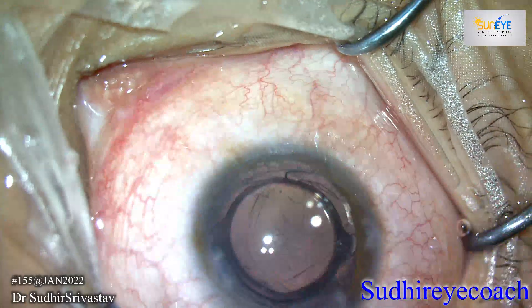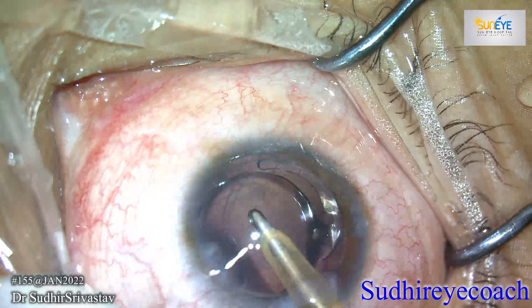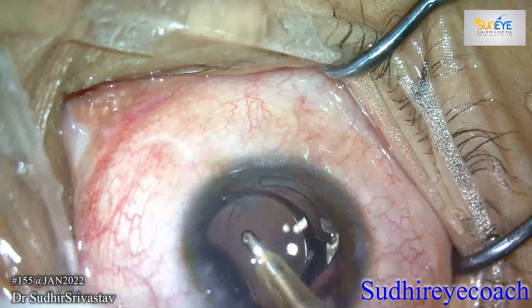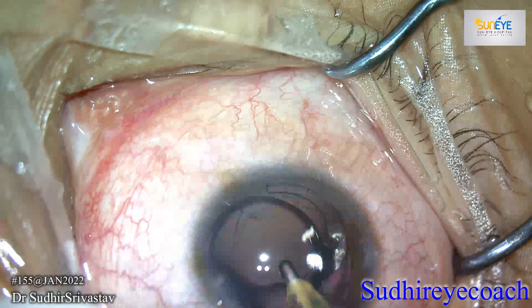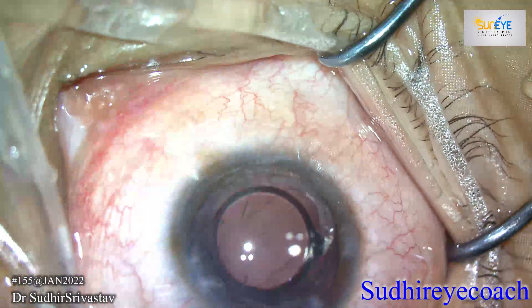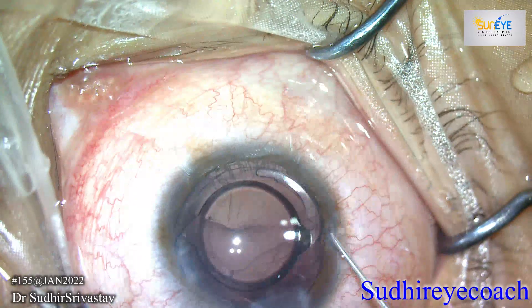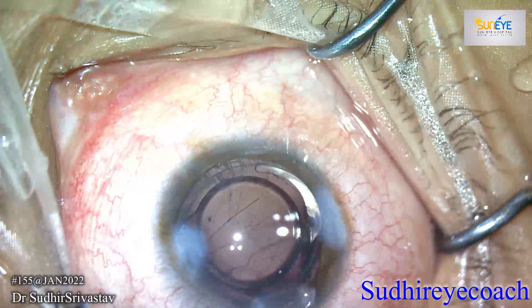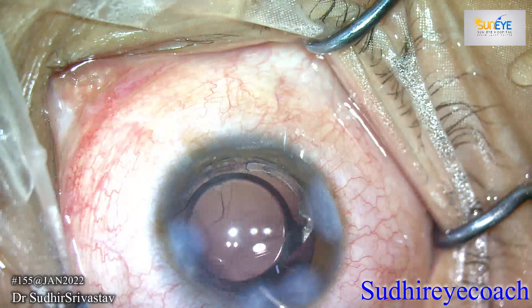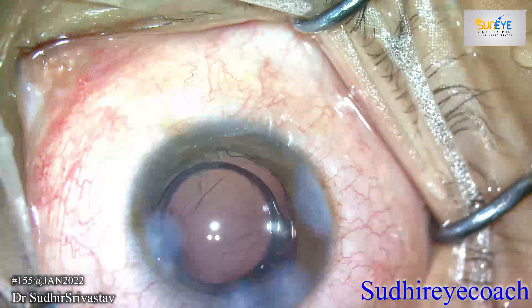After IOL implantation, always ensure it is behind the iris diaphragm. Sometimes, because of the lax zonules, the whole capsular bag along with the IOL may come anteriorly. I gently aspirated the viscoelastics from the anterior chamber — I simply tapped the IOL to remove the visco behind it rather than going behind the lens. As I withdrew the I/A tip, the entire capsular bag moved anteriorly, so I instilled a pupil constrictor intracamerally and waited until the pupil covered the edge of the haptics and the bag.